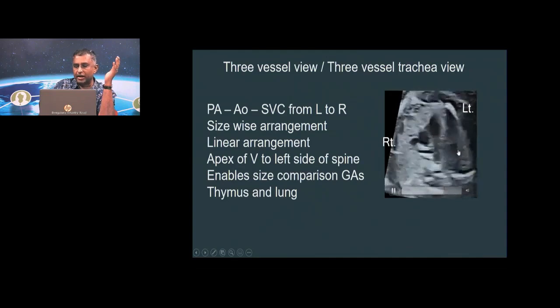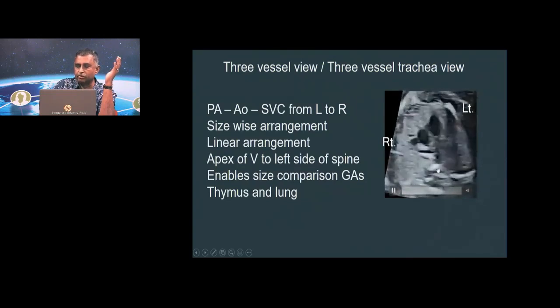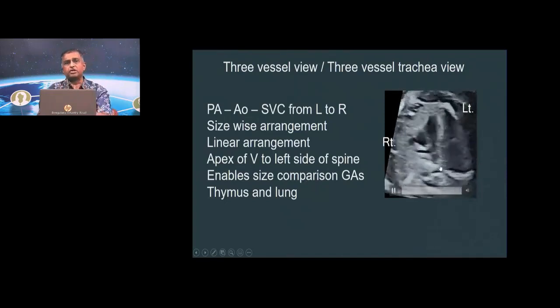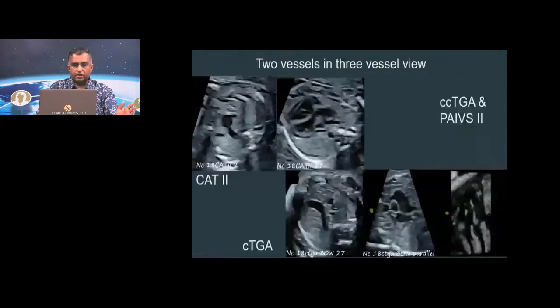and you have the lungs on either side. Remember, the V, which you can imagine through the aorta, through the ductus arch and the aortic arch, moves to the left of the trachea, moves to the left of the spine, and if you begin to have this in your checklist, you will never miss a right-sided aortic arch, right?